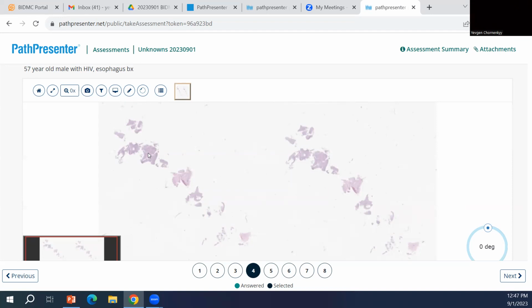No, but we've had some cases that we know are positive on H&E, and then to tell VZV versus HSV, we do both immunostains and both are negative. But we know it's positive. Do you report the immunostains? On something like that, I probably might not, or might make a note about it.